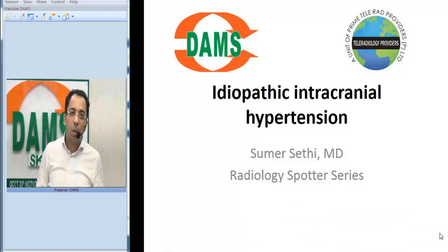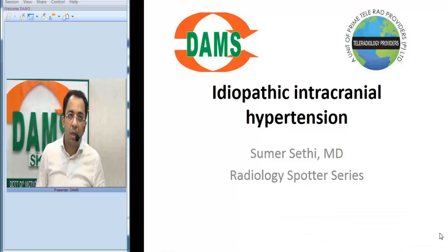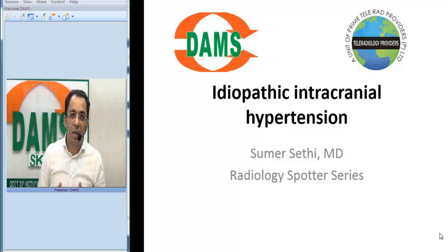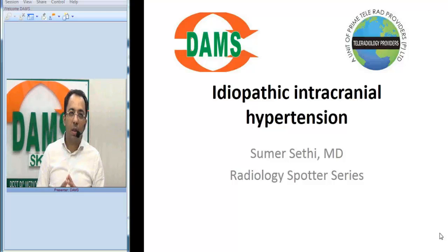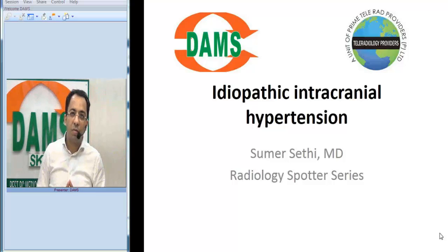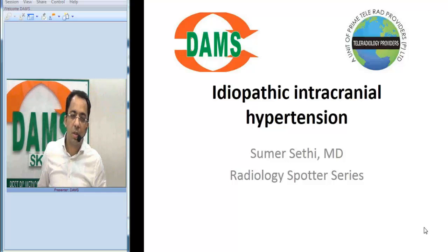Let us now discuss a radiology spotter image which is often asked to residents and undergraduates in their exams. It's a very interesting visual. Today we'll look at a neuroradiological case of idiopathic intracranial hypertension.